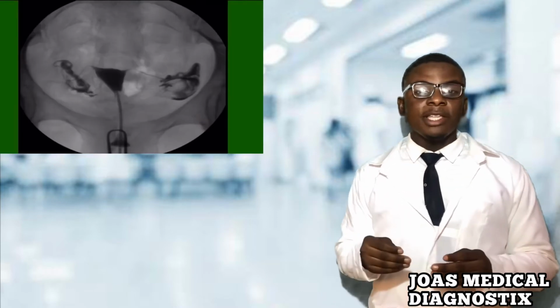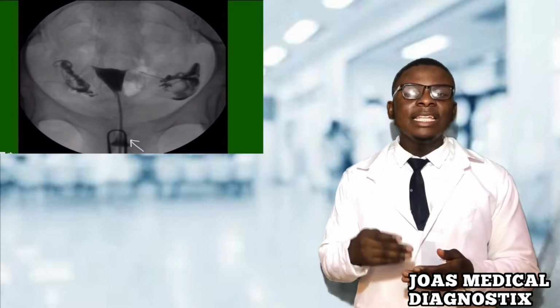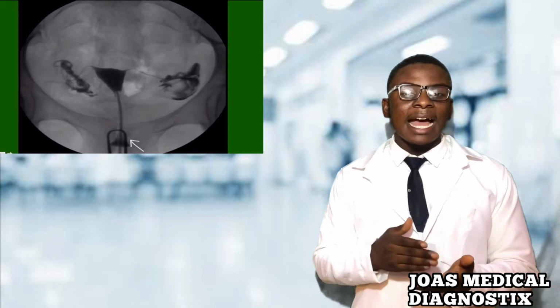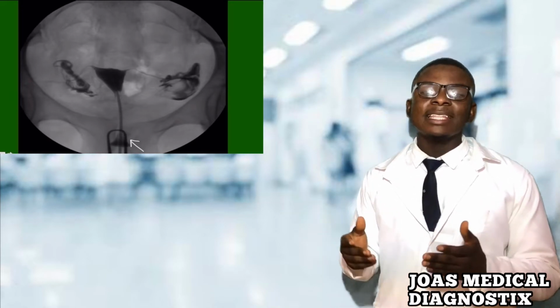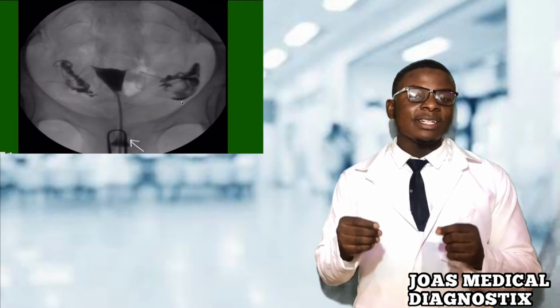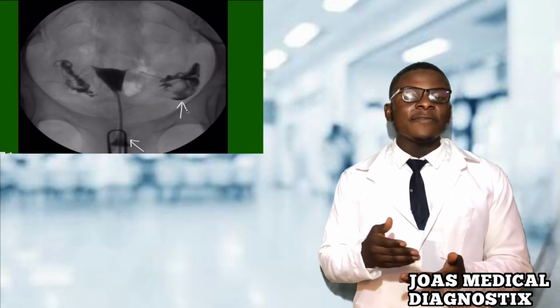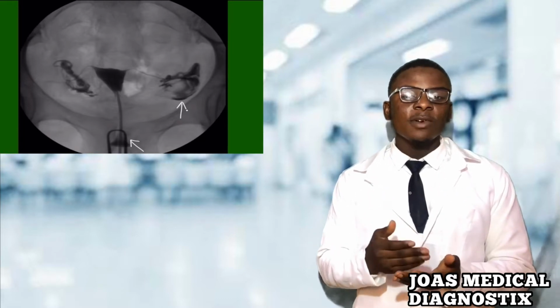This is another image of a normal hysterosalpingogram. First, take note of the single tooth tenaculum and cannula in the lower uterine segment. Next, we can also see the uterus and the isthmic portion of the fallopian tubes. We can also see the tubes are getting a little bit wider. That's the ampulla, and finally, particularly on the right side, you can see the crescent-shaped areas of the dye. This is the dye freely spilling from the fallopian tubes and wrapping itself around the bowel, giving us the classic crescent shape.